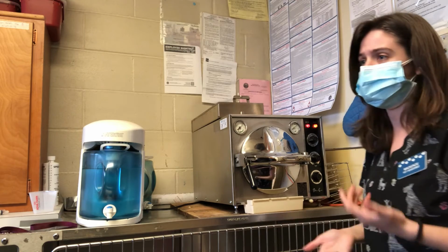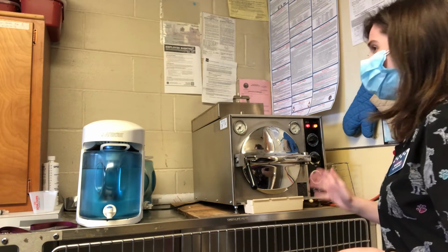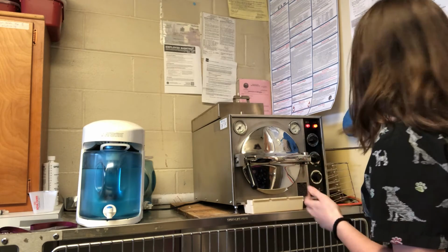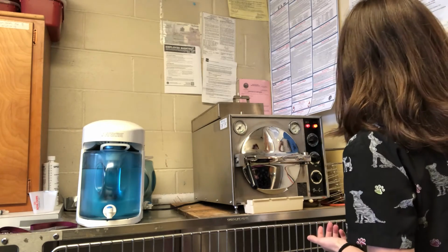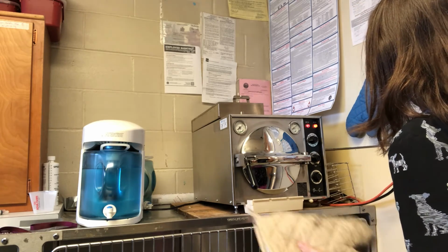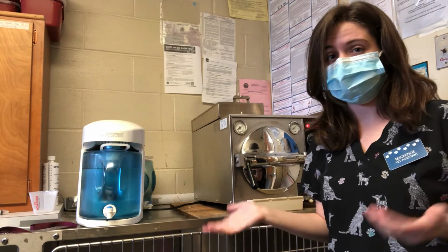The proper temperature for an autoclave to sterilize a pack is between 250 and 270 degrees Fahrenheit, and the PSI is between 15 and 30. So once it reaches there, which takes about 15 minutes, then for a pack like this, where it's heavily wrapped, we can go ahead and take a look at our cheat sheet here, and it says that it should take about 25 minutes at 15 psi, or 10 minutes for 30 psi. So we'll go ahead and leave that and check back in with it when it is finished being processed in the autoclave.